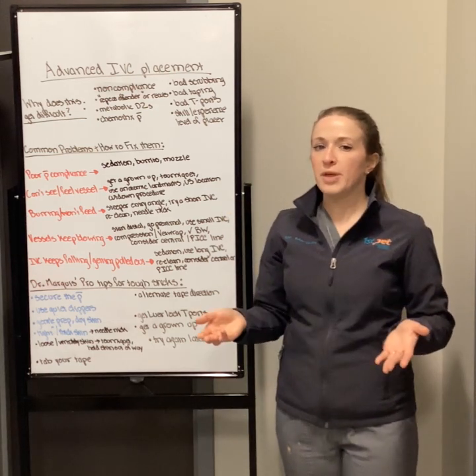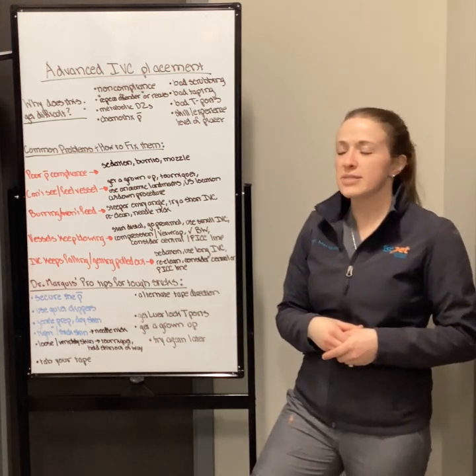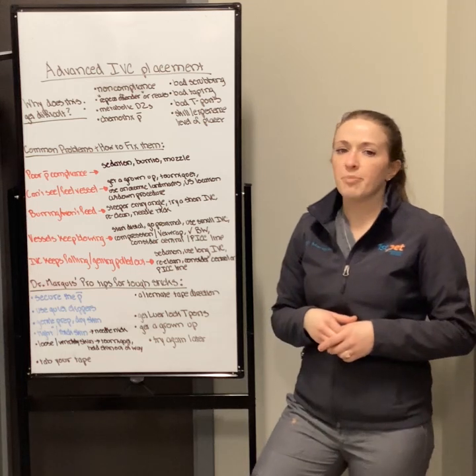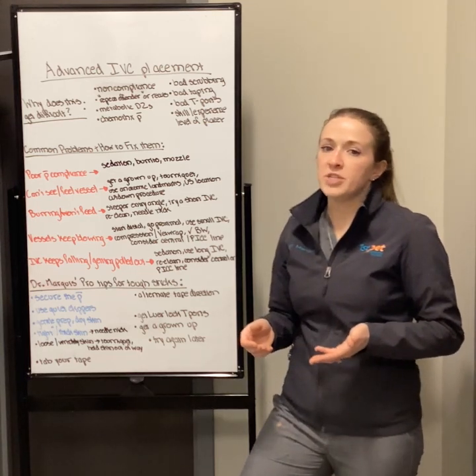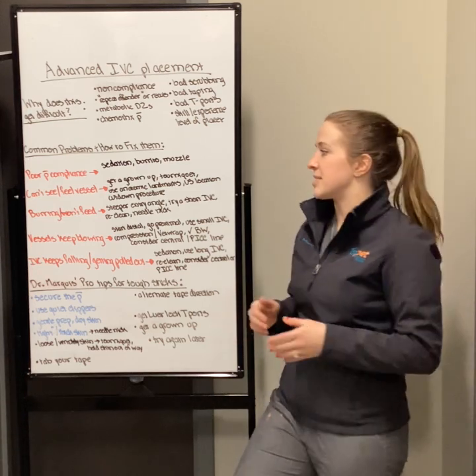So lots of people think that tourniquets are just for big dogs, but if you have a dog that has lots of loose skin, or something like an abnormal leg, then using a tourniquet can just make your life easier, because usually the longer the tourniquet sits, the easier the vessel gets to see.